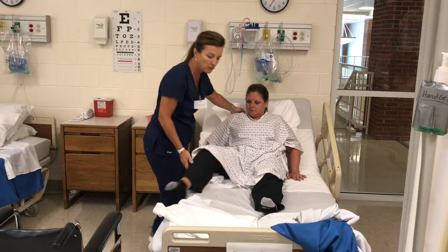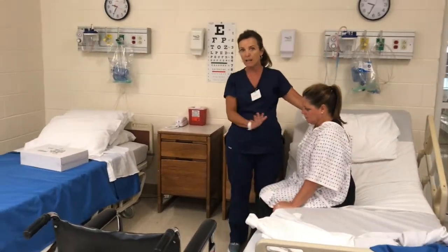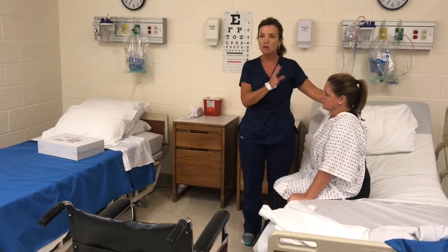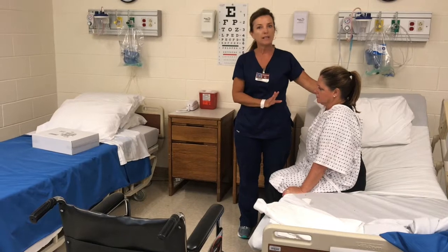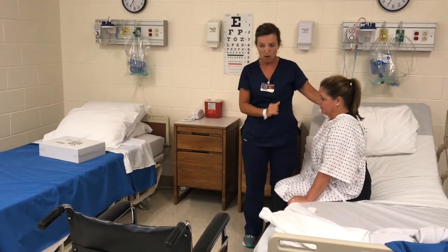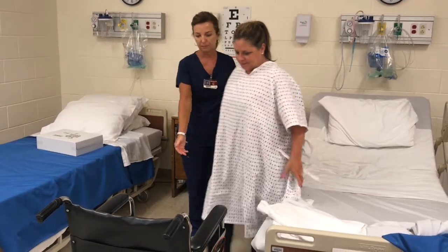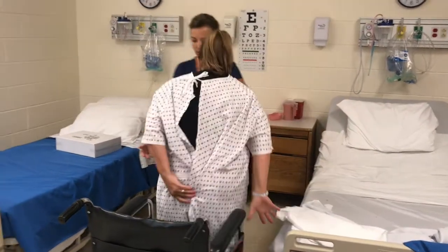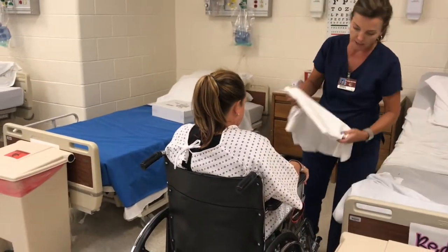I'm going to help my patient up to the side of the bed and we're going to dangle. Now you've watched that video so you know the signs to look for — are they pale? Are they having trouble breathing? Do they look like they're in any kind of distress? Are they dizzy? Do you feel okay? I feel fine. So let's get in the wheelchair. I'm just going to assist. My patient doesn't really have any mobility issues so we didn't need to use a gait belt.